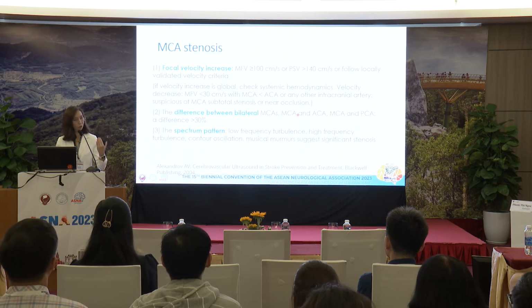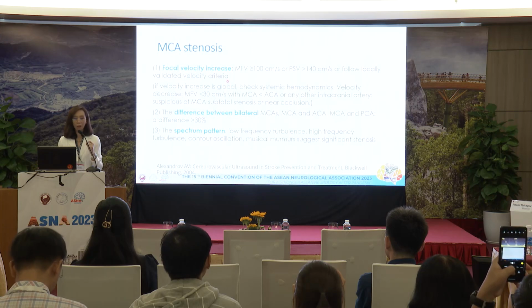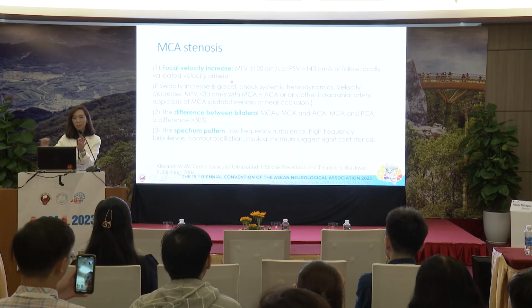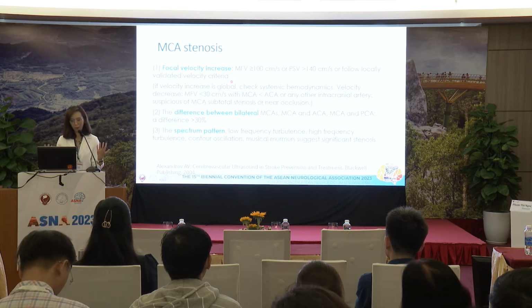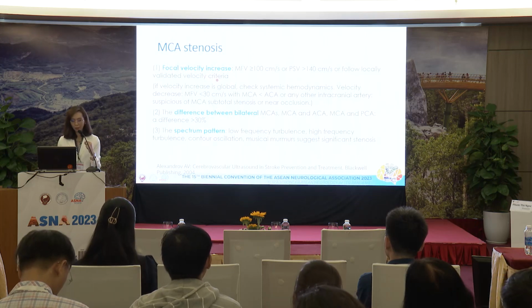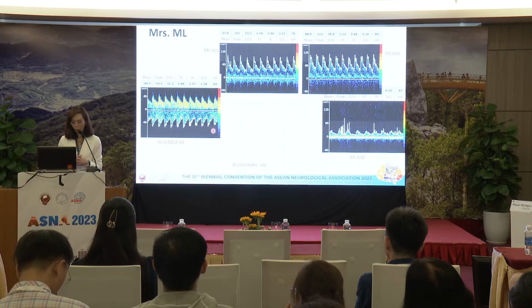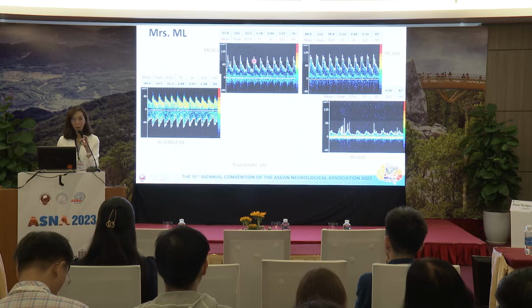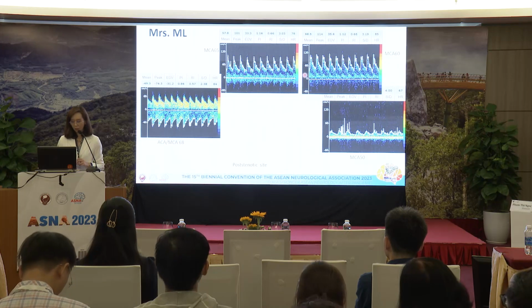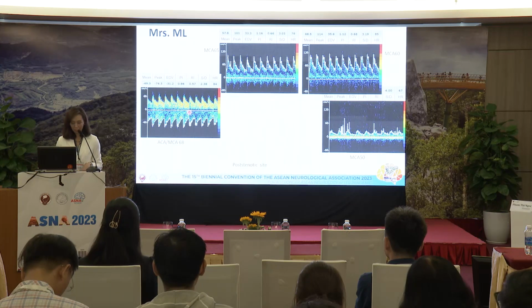There are some criteria, and Ramani has mentioned some of them. And what we expect is to have focal velocity changes, right? If the velocity is the same at all depths, it would be normal, or no focal stenosis. But if you see focal velocity changes, it's very likely that it's a stenosis, right? And this is what it looks like when we perform TCD on the patient that we are having. So this is at the depth of 65 of the MCA here, depth of 60, depth of 50, and this is 68. What do you think?